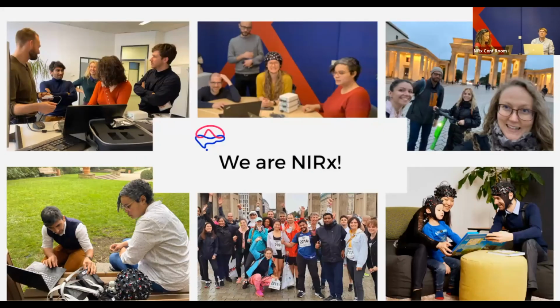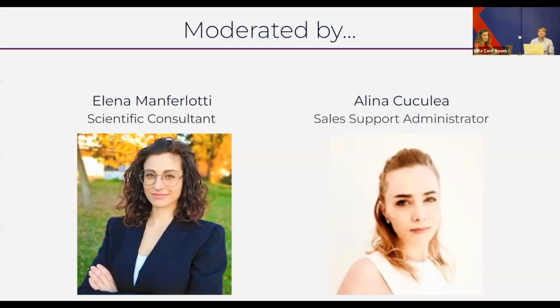We here at NIRx have been trying for 20 years to give the best and most easygoing solution for fNIRS analysis. One feedback that we always receive from our customers is that they would like to have software that is user-friendly and helps them through the steps of the analysis. And this is what today Michel is going to show you.